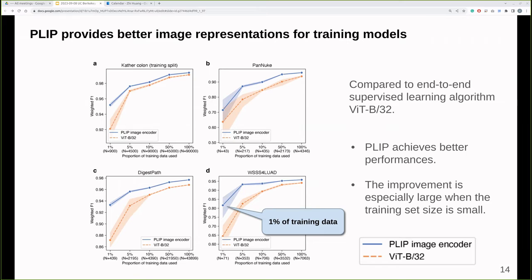Any questions so far? Sorry, another question. What's the task here? What's the specific task for these two datasets? Is it survival prediction or whole slide image class label prediction? Yeah, that's a great question. It's not survival prediction. It's just a binary or multi-class classification task. You do multi-instance learning by first cutting the slide into patches and extracting visual representations, then using attention-based methods to do the prediction. Because it's a gigapixel image, you can't just use it as input and get the output.